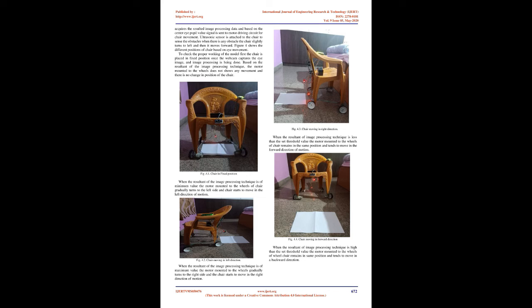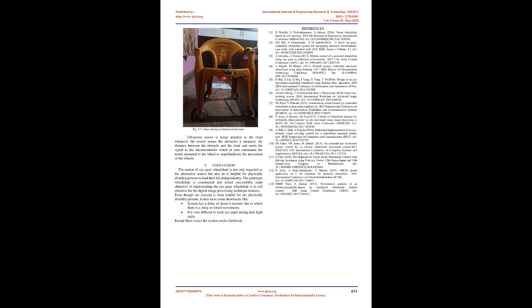See system flow chart. Initially, region of interest of eye is being cropped where all the possible circle presented on that particular area is being detected. Later it detects the eyeball. Once the eyeball is successfully detected, we apply corner detection method to find out corners where center point is the average of the distance between eye circle center point and the center point.